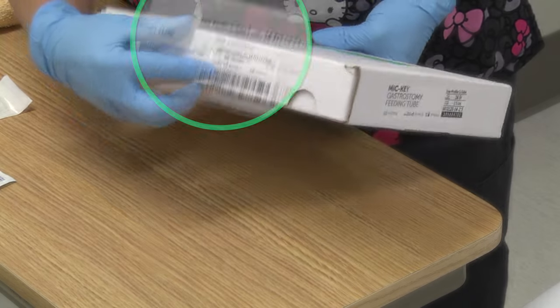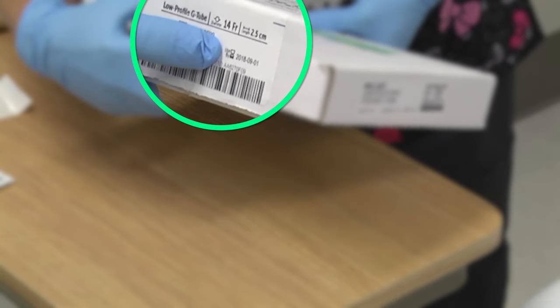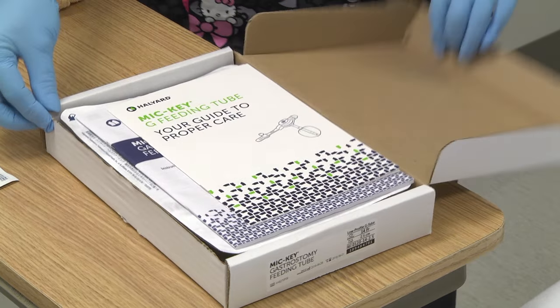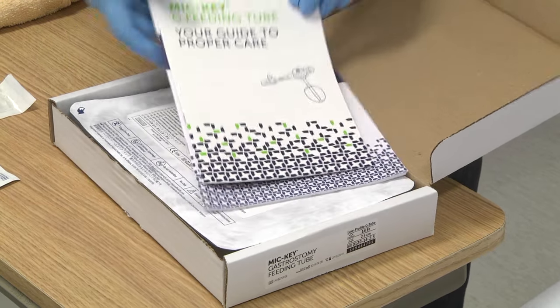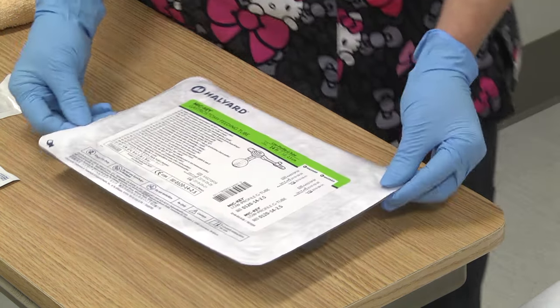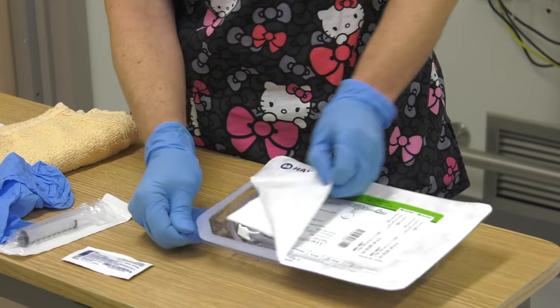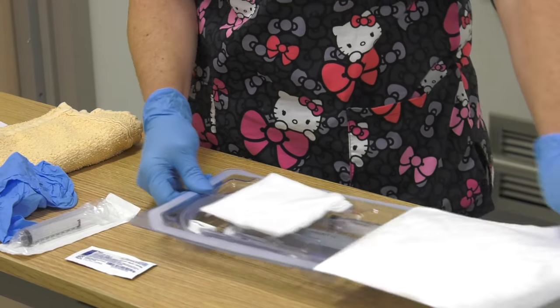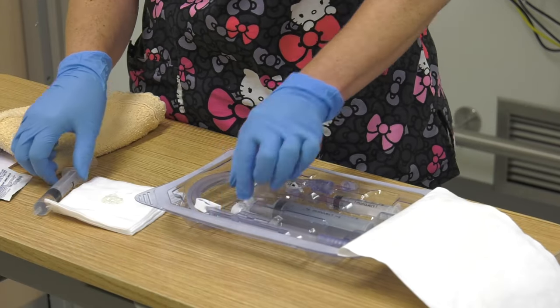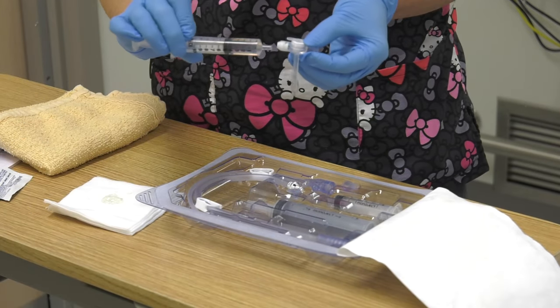Check that the Mickey button is the correct size and check the expiration date before opening the box. Remove the new Mickey button from the package and inflate the balloon with five mils of water to test the integrity of the balloon and ensure the valve is functioning properly.